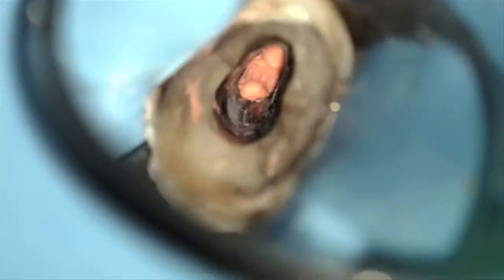I found that you don't necessarily need special post-space drills for GuttaCore. I can't say the same with other carrier-based obturations, however.